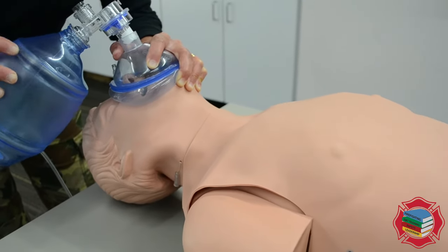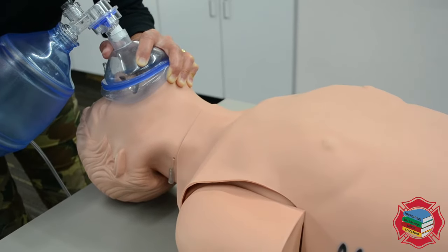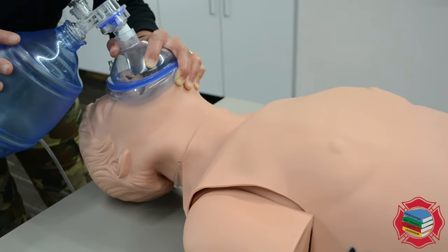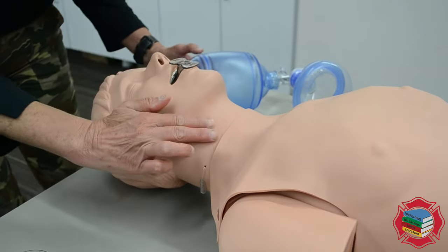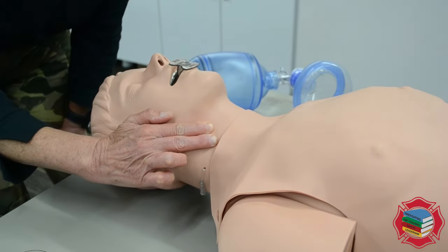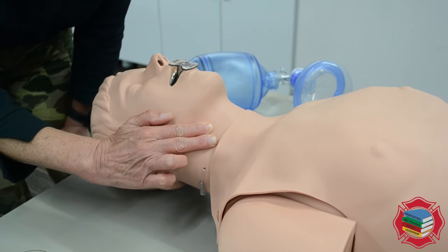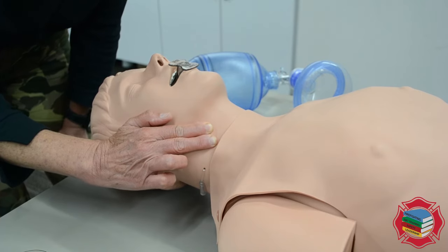When you're ventilating a patient who has a pulse but is not breathing, it's important to reassess the pulse every two minutes. After two minutes of ventilating, I'm going to reassess the carotid pulse because it's difficult to tell if a patient who is not breathing still has a pulse — especially if they're not on a monitor. I'm going to check the pulse for five to ten seconds.